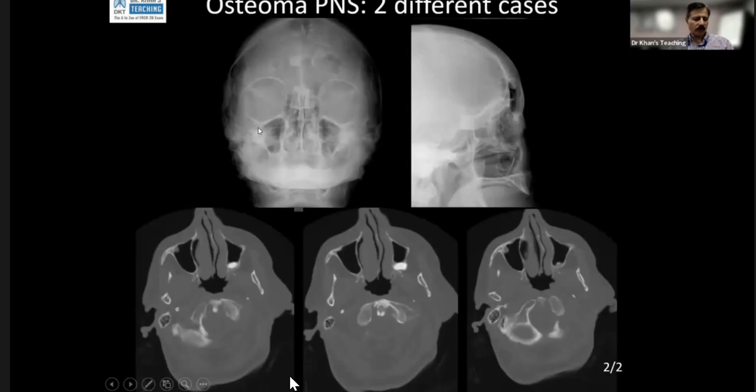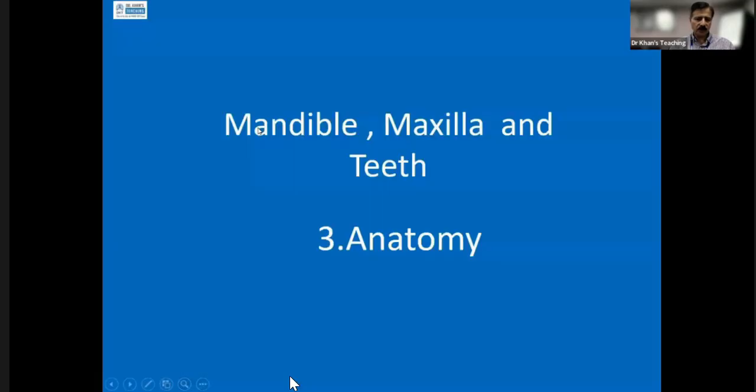no significance. But beware of this in Gardner's syndrome. So a long case can come in which there will be ivory osteoma of the paranasal sinus. And with this, any stigmata of Gardner's syndrome, including desmoid tumors, etc. We have seen these cases when we did our GIT.